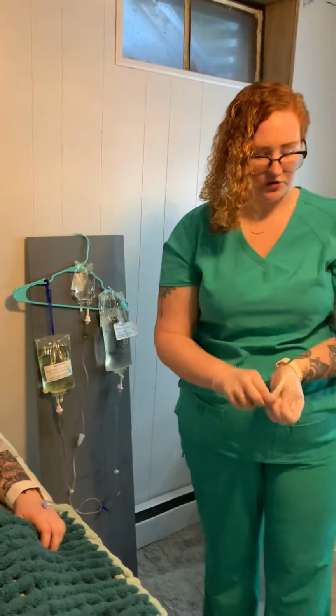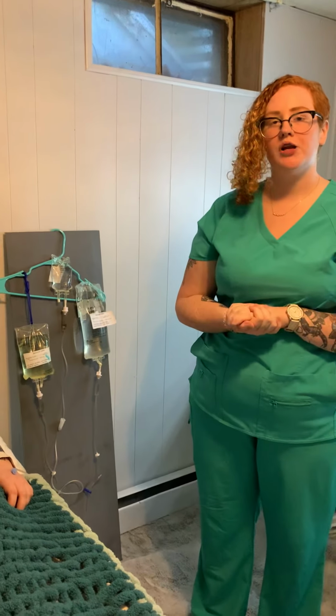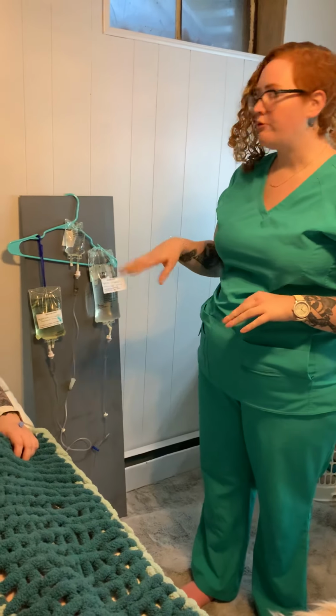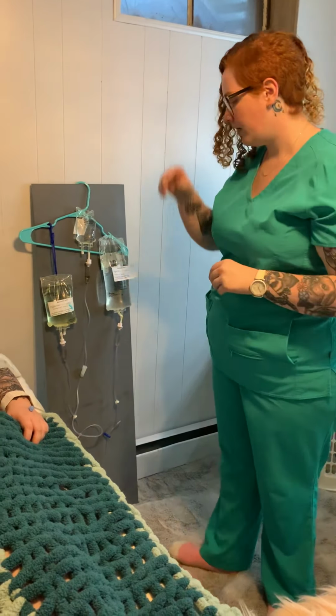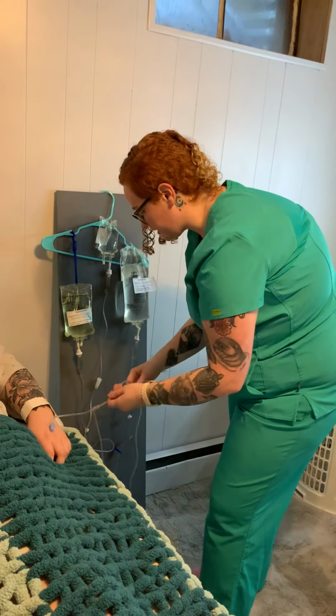At this time, remove your gloves, perform hand hygiene, and let the infusion run. We will let this run for half an hour, as the 200 mLs per hour will last about half an hour with 100 mLs of fluid. After the infusion of the antibiotic, we will remove the antibiotic and we will let 30 mLs of the flush bag run through. After this, we will have to disconnect the flush bag tubing.